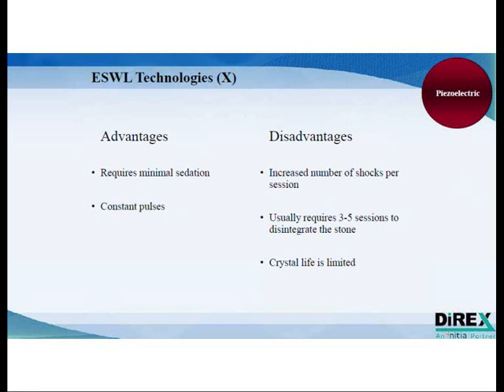So this technology, of course, has only been distributed by a single company for now. The company is Wolf, and usually it is sold to clients who already own Wolf endoscopes. That is the way to enter to sell a piezoelectric lithotripter, because there's no justification for purchasing this lithotripter as compared to any other.